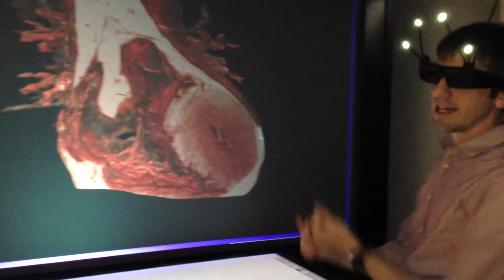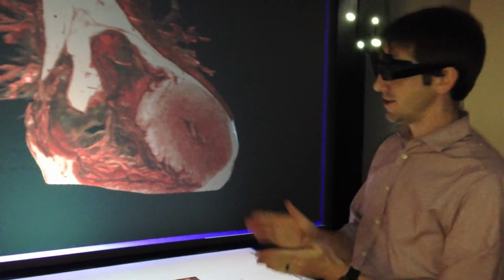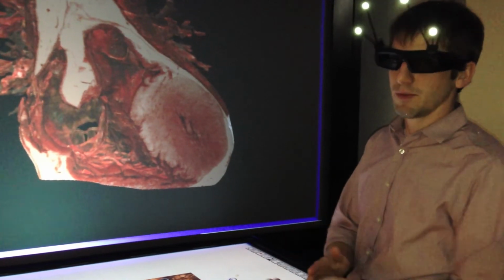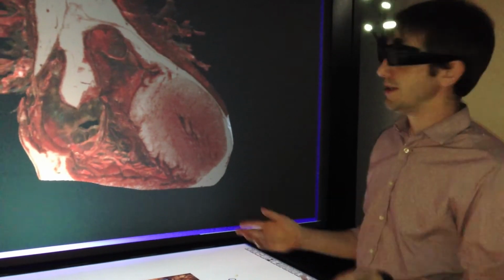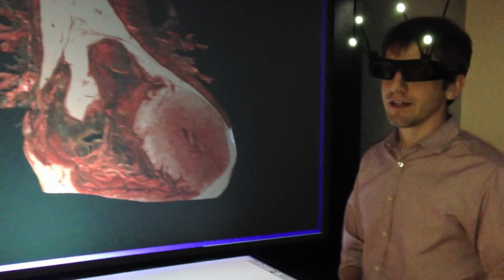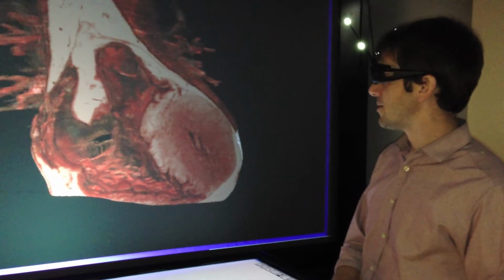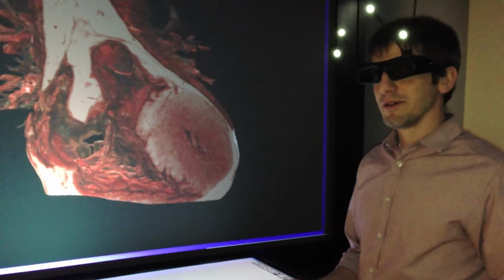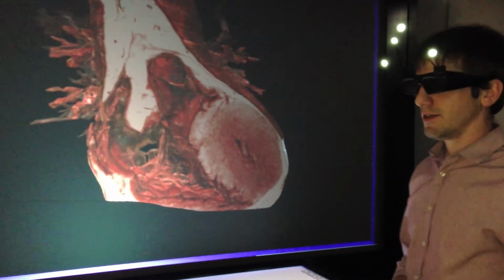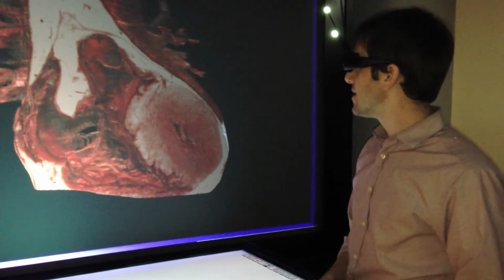So this is human data. You could also do the same with CT files, so those are fairly easy to come by. So you could do not just one, but 100 virtual implants just for your cost of time, rather than going through animal experiments or animal studies, which, while fairly comparable, are not human studies. So it is kind of another intermediary.